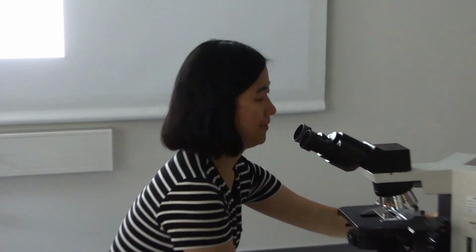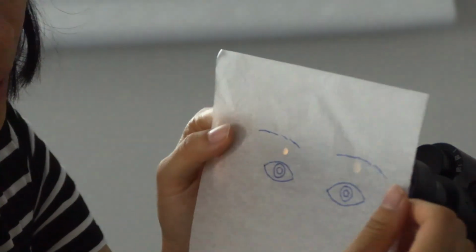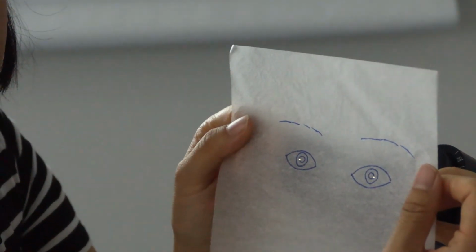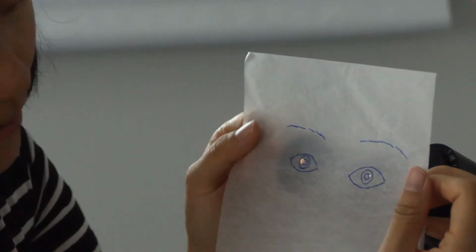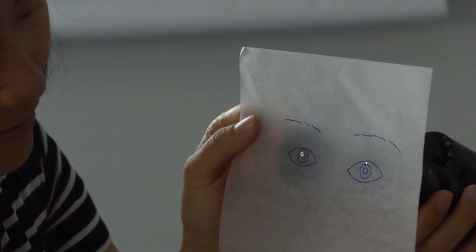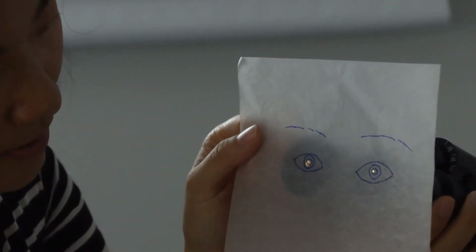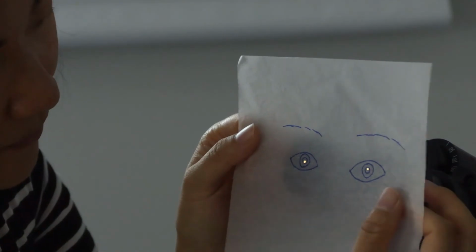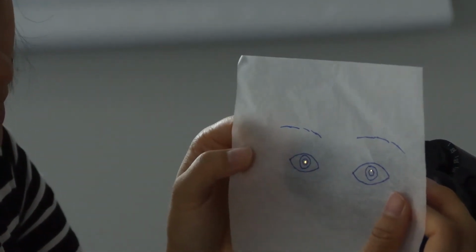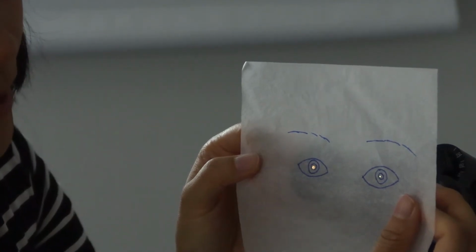If we just turn a little bit, you can see it's not really focused on the eyes. So what we want is both of them focused on each of your pupils.